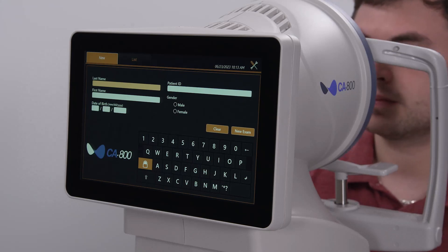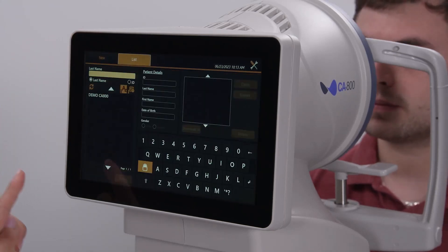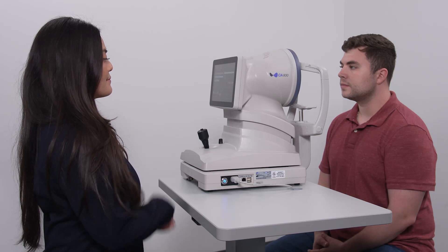After entering a new patient or selecting an existing patient and activating the scan acquisition, start with the CA800 pulled back towards the operator as far as the instrument will allow.